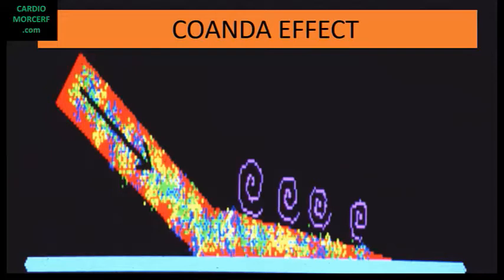Now, there is a physical law called momentum conservation that says that within a closed system, momentum is always conserved. And what is momentum? It is mass times velocity. Then, if mass increases, the velocity must decrease. So the velocity of the upper free layer will decrease in relation to the wall's layer.